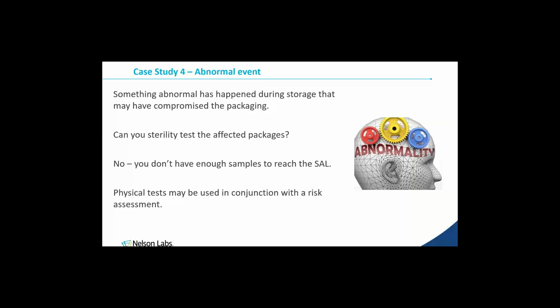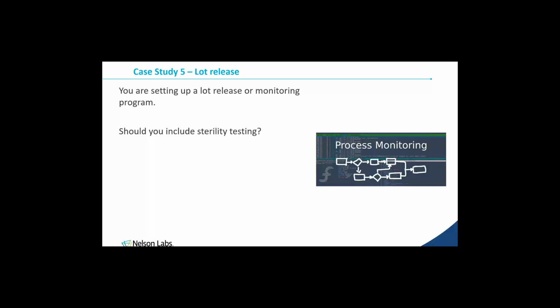Right, and that's something else you would be looking at in a risk assessment: not just from a sterility assurance level, but how functional it is, and whether that event damaged the product in any way as well. So let's move on to case study number 5.